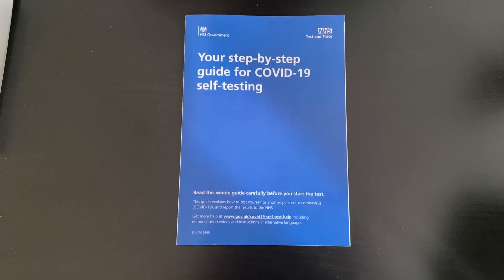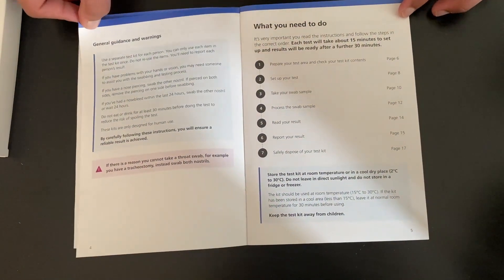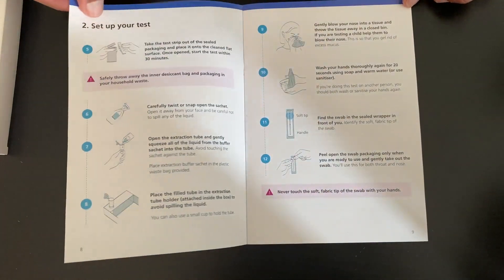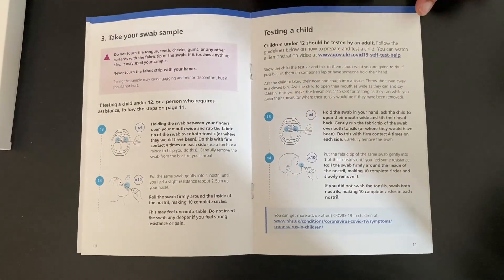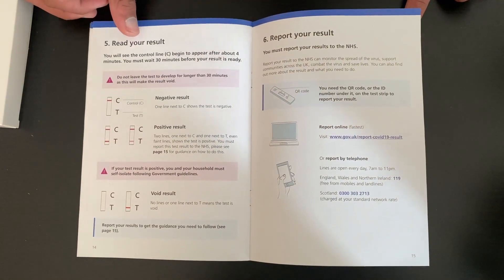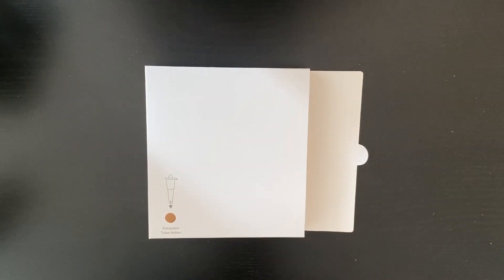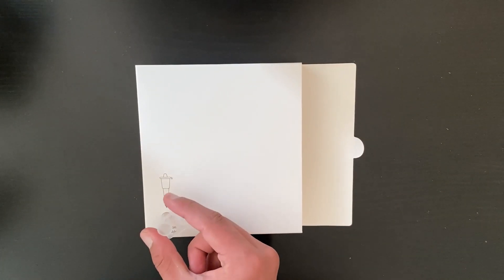Before you start you should always read the guide first. So let's start. The first thing we need to do is put the extraction tube in the extraction tube holder to make sure that it doesn't fall down.